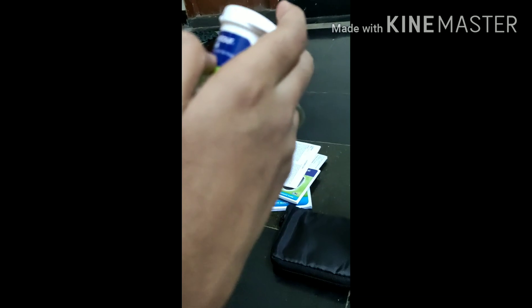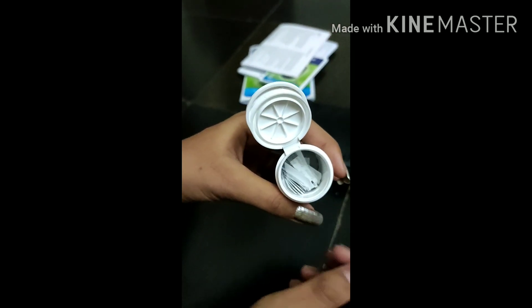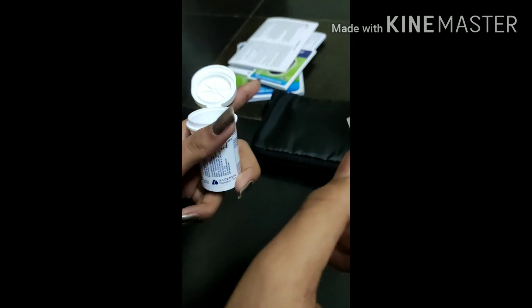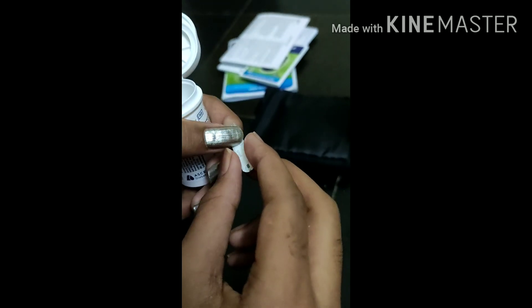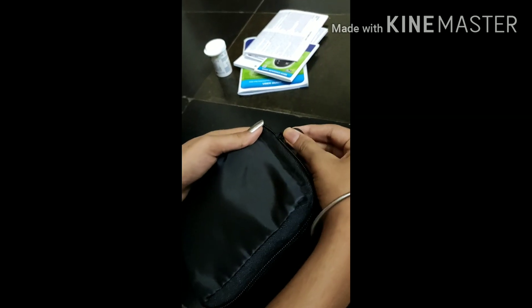Next you have the blood glucose test strips. You can see here — you should insert this into the machine. I will show you how to insert them.